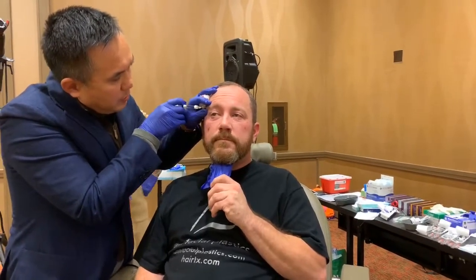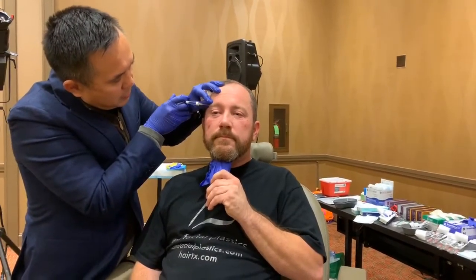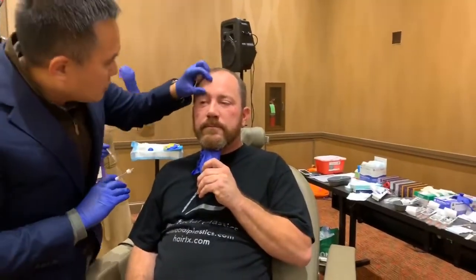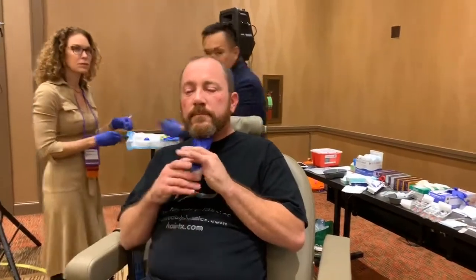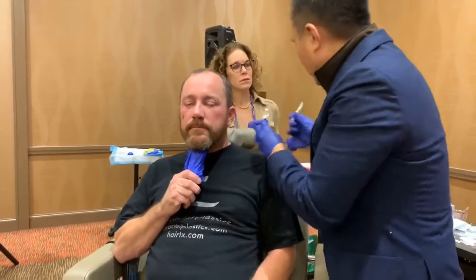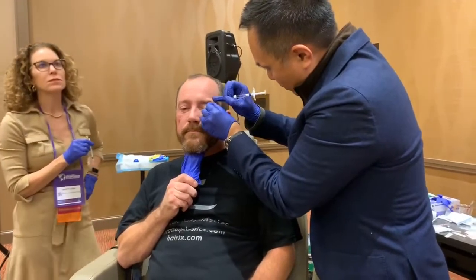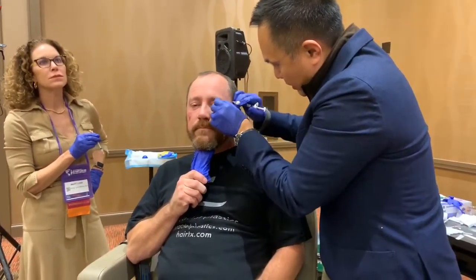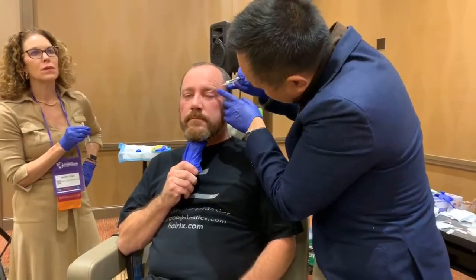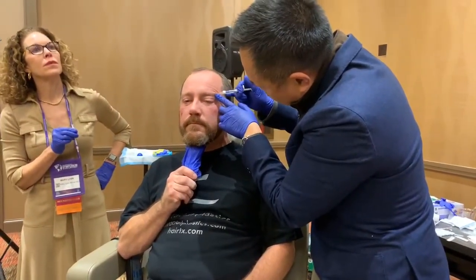I encourage everyone to constantly think creatively and innovate. The more you fill, the more you see, the more you change your perspective on what is attractive and youthful. He's lifting a little bit up here — there's some pre-existing asymmetry. When you do lateral brows I would be very cautious about adding too much, because too much weight in the outer brow can actually take that long limb of the triangle and make it look worse. So you have to be very careful.